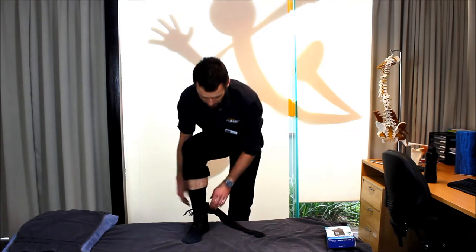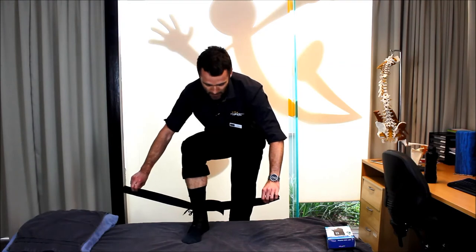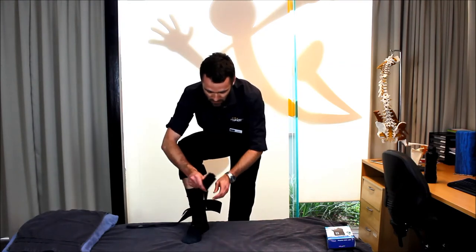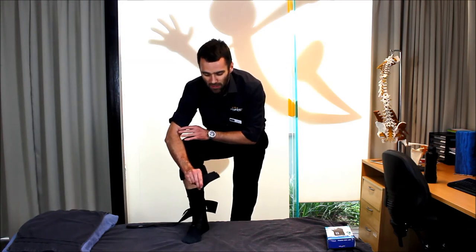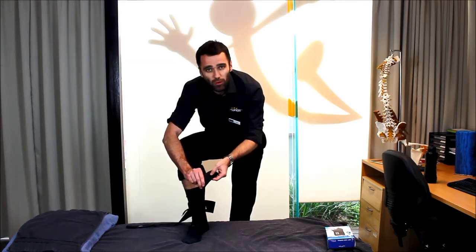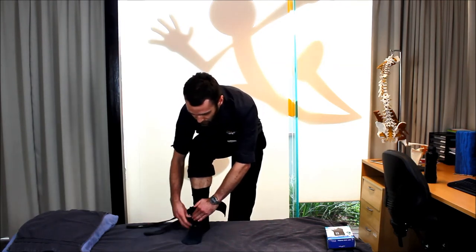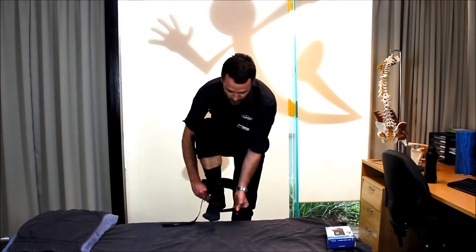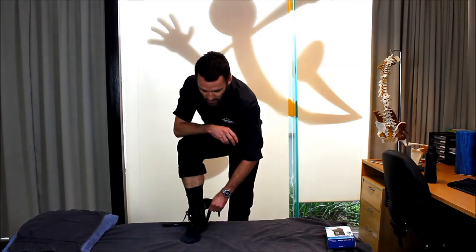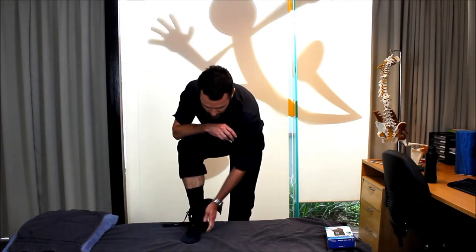Once we've done our laces up, it's time to do up the stirrups. The stirrups — there's two of them — are these long straps that you'll see here. In order to do them up, think of a figure of six, and the velcro will guide you in terms of the correct way to do it. You simply just wrap around the front of your ankle, coming up through the side, then pull quite firmly in that position and lay the velcro down.